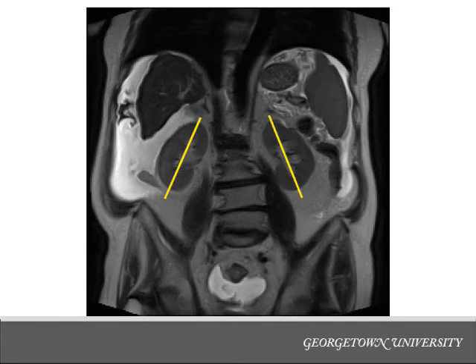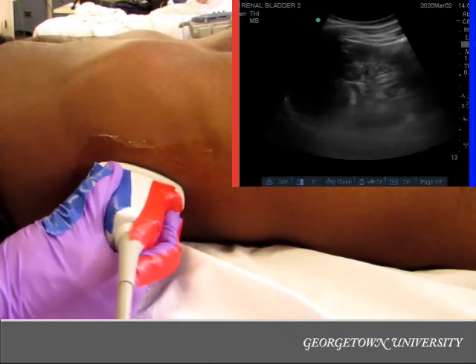Finding the left kidney is similar, though is often slightly more superior, and when using the spleen as an acoustic window, it is more posterior.